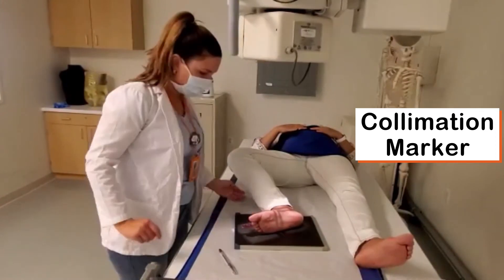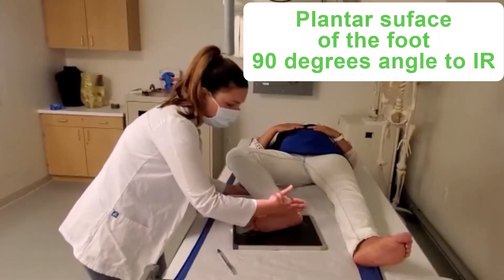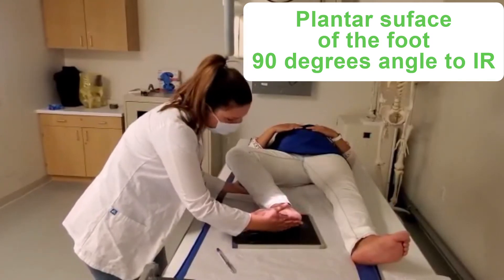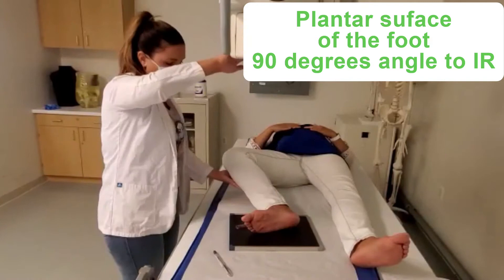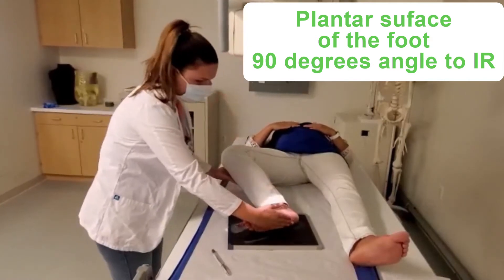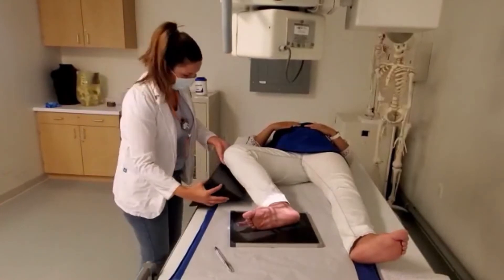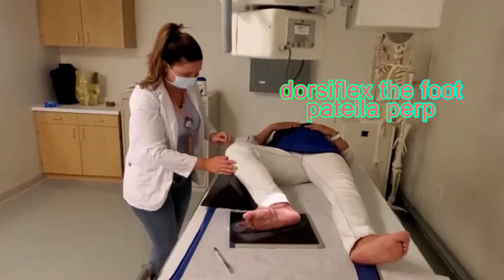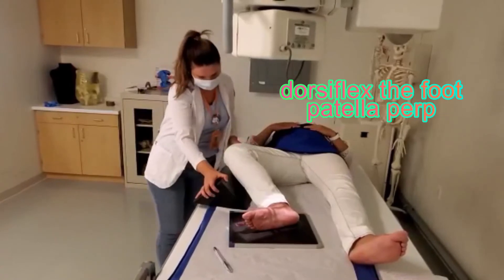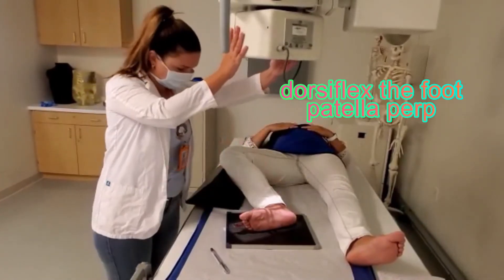We place our marker correctly, and the plantar surface has to make a 90 degree angle to be perpendicular to the surface of the IR. For this we will be using a sponge to hold the knee in place, have the patella perpendicular to the table, and achieve the angle that is required.